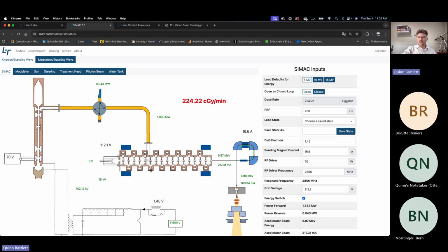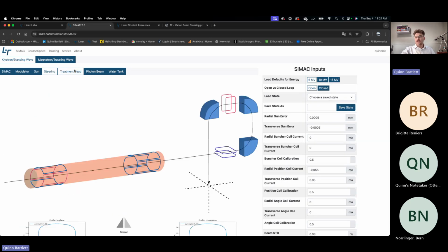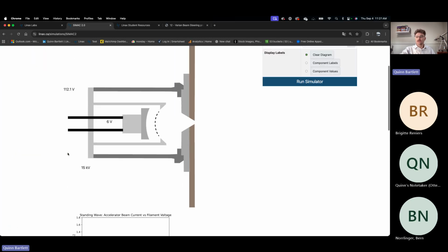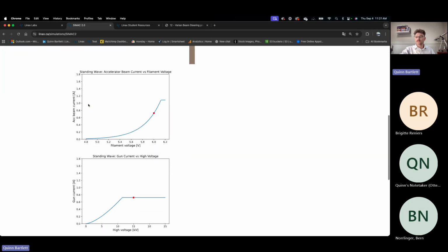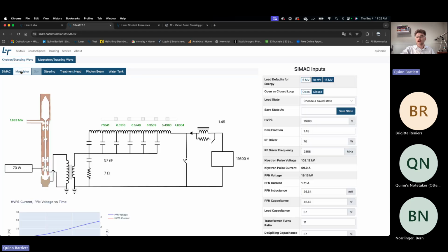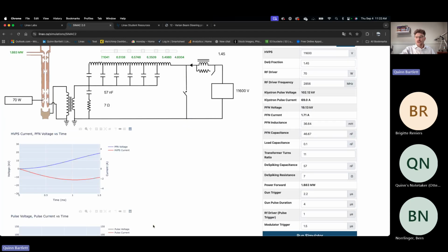The only way you need to do that is in any of the steering and treatment head screens, or actually any of the screens. In the modulator and the gun, you'll notice we have a couple different versions of graphs. Unfortunately, in our guns, you aren't able to grab the data. In our modulators, in this format of graph, you can, and you can see here, you can download the plot as PNG, zoom out, zoom in, show closest data, hover, compare data, produced with Plotly.